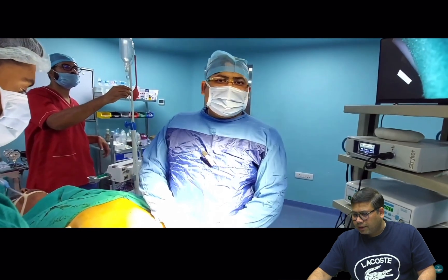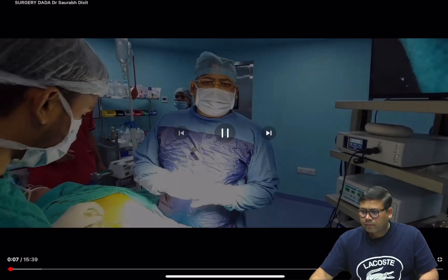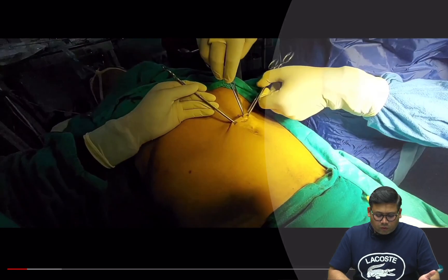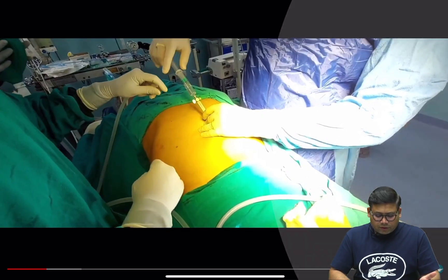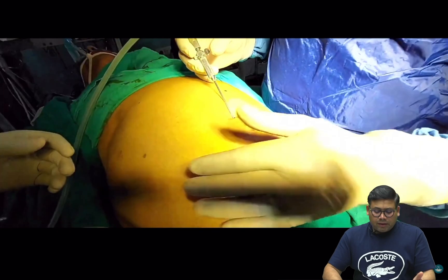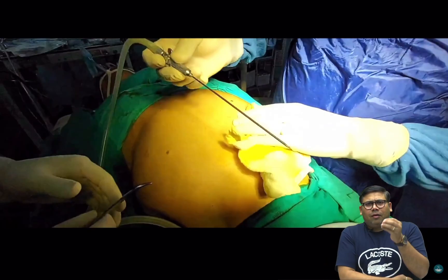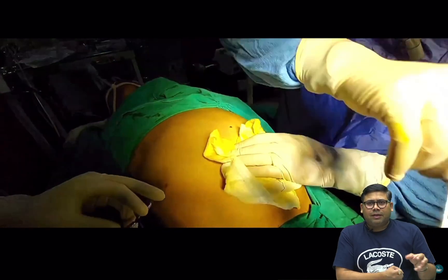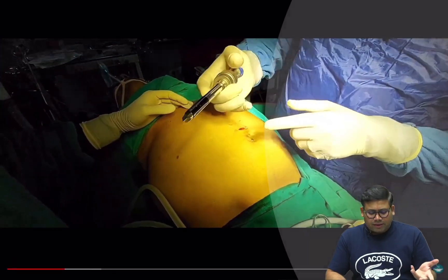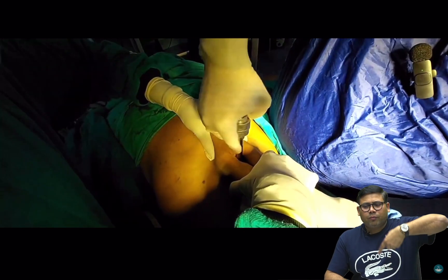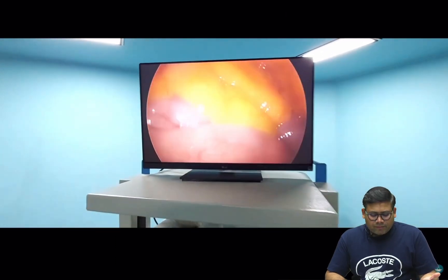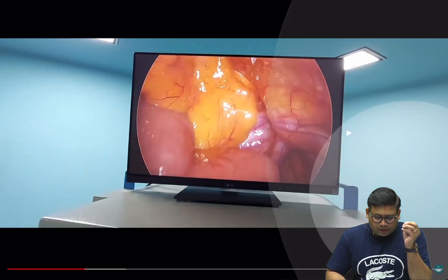This is a very interesting case. First, identify the target and go for the Veress axis — here I'm going for a supra-umbilical axis. At 0.6 liters of gas entering, there is loss of liver dullness, confirming pneumoperitoneum creation. Then exchange with a port using a corkscrew movement vertically with a hissing sound. You can see the contents — this is a classical left-sided inguinal hernia.